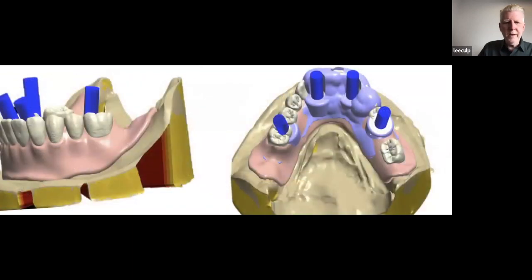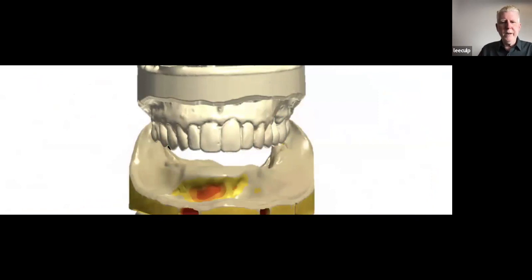But again, bringing in all of these data sets together with the guide, the teeth, the dentures, where everything is going to go, and putting all of this together, and then simulating bone recontouring. So I, on the STL model, reduced it down to where it needed to be. We were able to put that back into the CT, and we were able to see very, very quickly, we don't need to grind off a lot of bone.